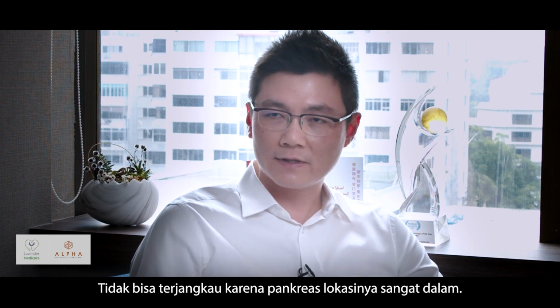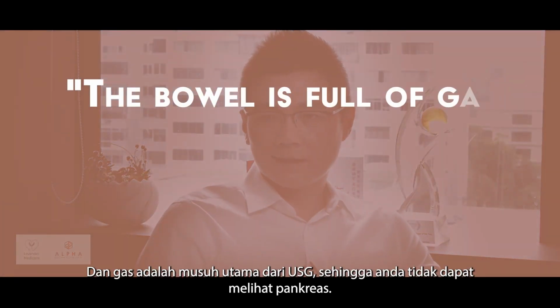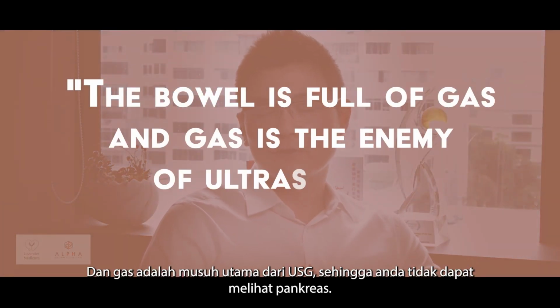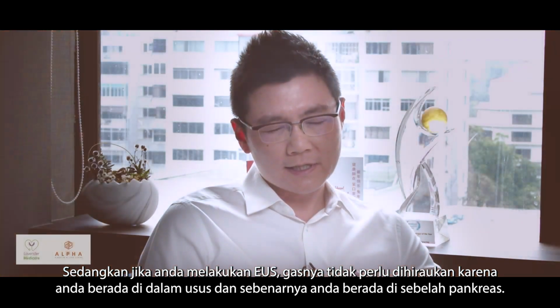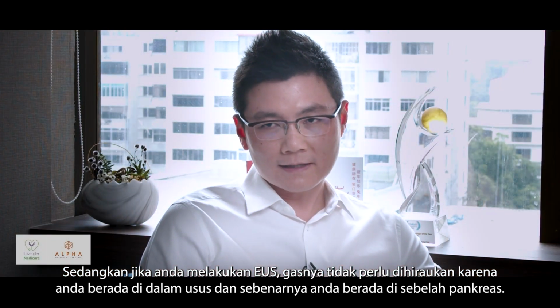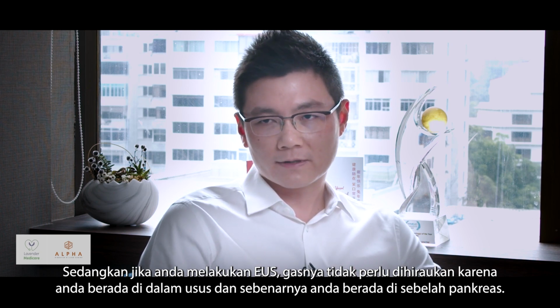It can't reach because the pancreas is very deep, and then it's behind bowel, and bowel is full of gas, and gas is the enemy of ultrasound, so you cannot see the pancreas. Whereas if you do an EUS, then the gas is out of the equation because you're in the bowel and you're actually right next to the pancreas.